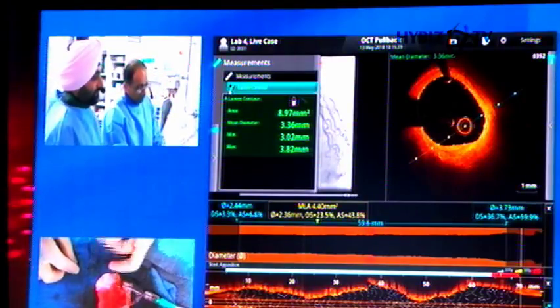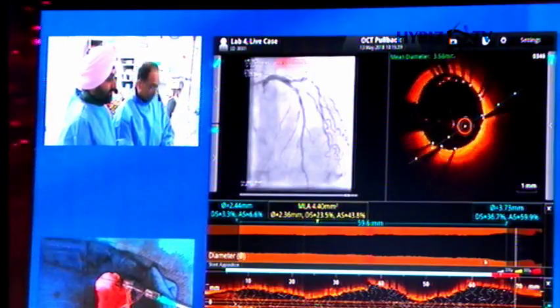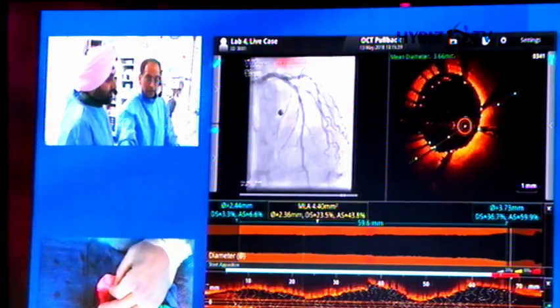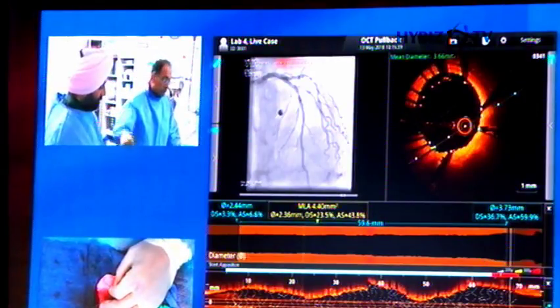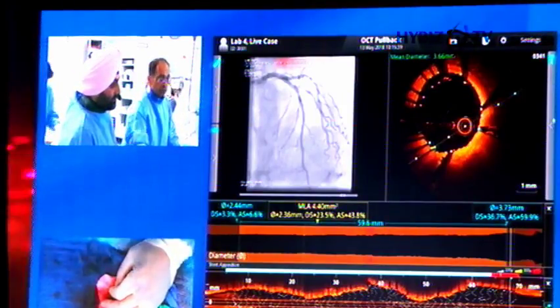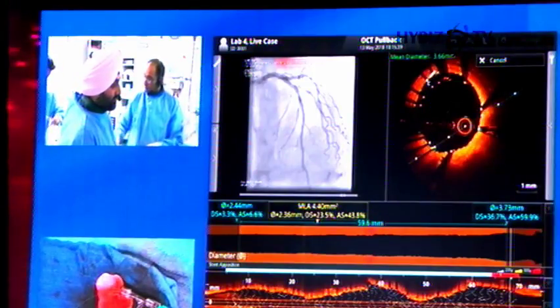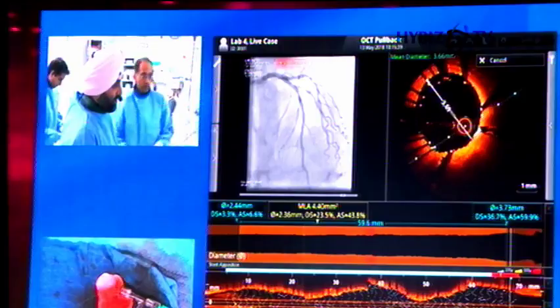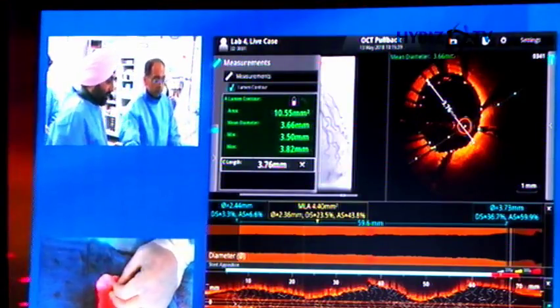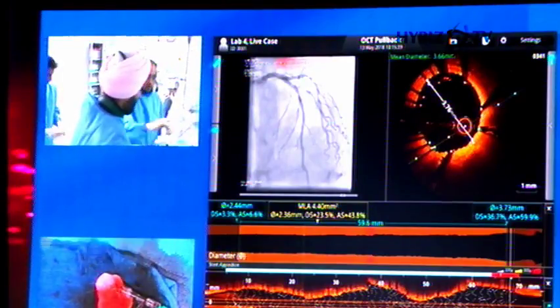My feeling is in the angiogram and the midsection we need to dilate slightly higher pressure where the overlap is. Yeah. So we're going to take a new 3.5 balloon. Typically, with lack of apposition, we're having difficulty using an old 3.5 NC balloon to go through the proximal struts, and so we're going to get a new balloon, 3.5 by 12, to go through. So just in terms to get apposition to that lumen, it will be 3.75, just as I've shown down the axial view. We can use a high pressure with this. Okay, that's the balloon ready.